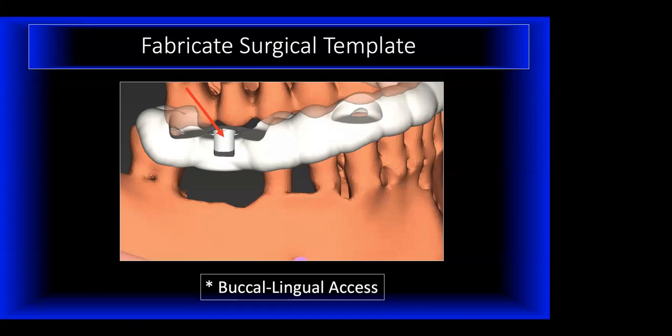It's a neat little trick, and it saves you 5 millimeters, which is about the size of the extension that those guided surgery drills have versus the regular standard surgical drills. Again, you have to ask for that, but certainly a first and second molar would be a great time to use that buccal or lingual access on the surgical template.